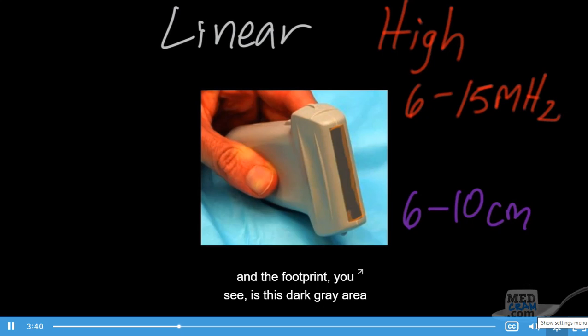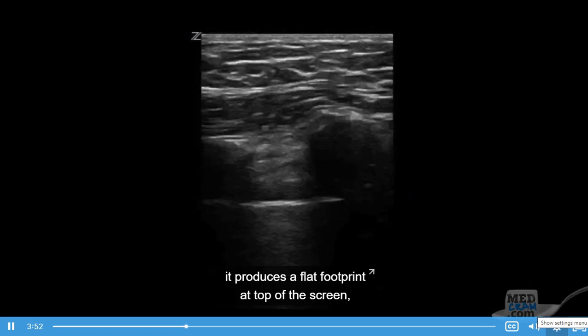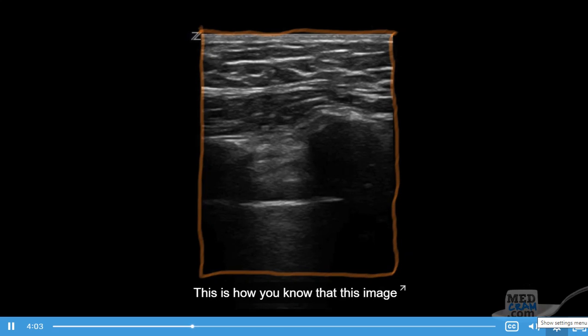Now, the footprint you see is this dark gray area that I'm outlining, and this is the part that touches the patient. And because it's flat and linear, on the image of a linear transducer, it produces a flat footprint at the top of the screen, and then a rectangle or square-like image. This is how you know that this image is produced from a linear transducer.